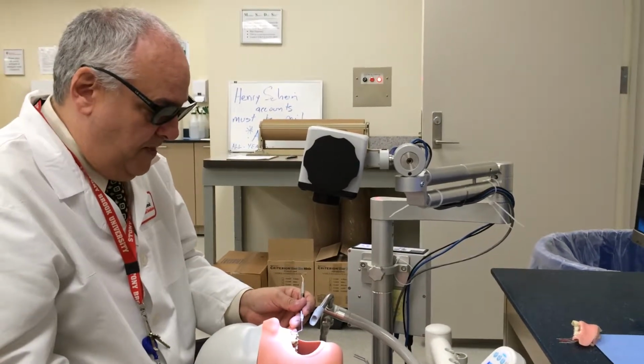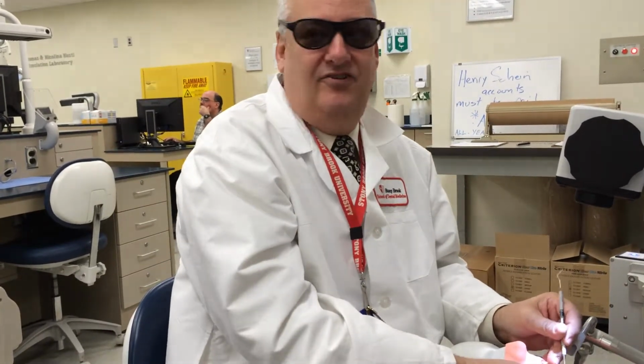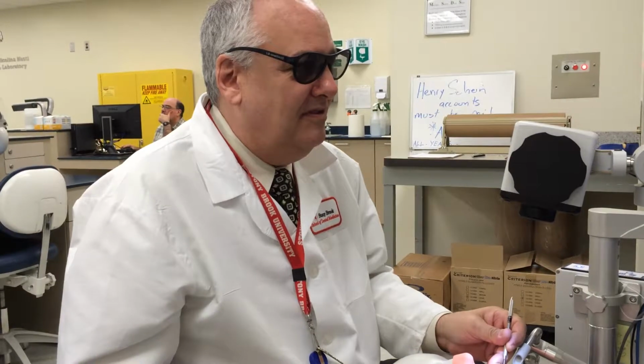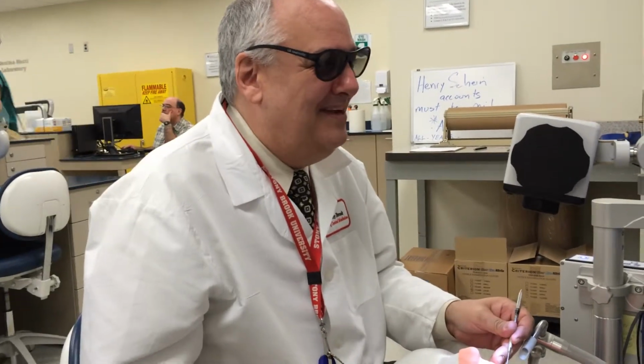Here's the question. I'm very comfortable with indirect vision as a dentist. So I'll come with a mirror and I'll do indirect vision. You do the same thing. Why am I having a little more, I can sense there's a little more of a learning curve. Because it's not a mirror. Because you're direct, almost looking at it like it is a mirror. Is that what it is? Yeah, my brain is mapped. Exactly.